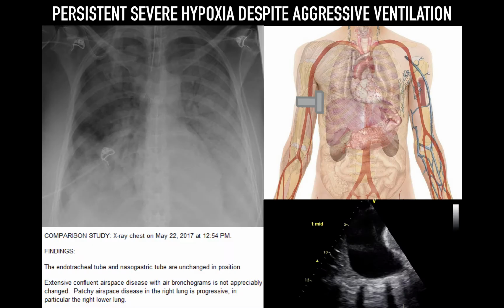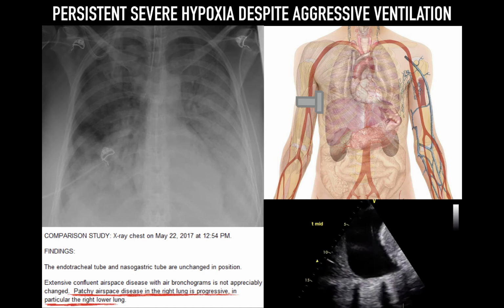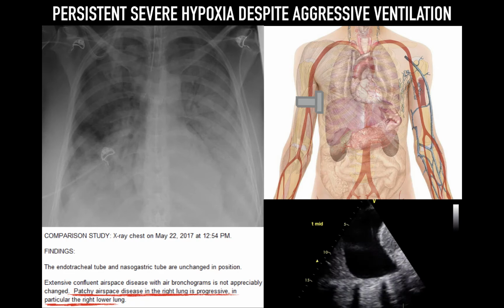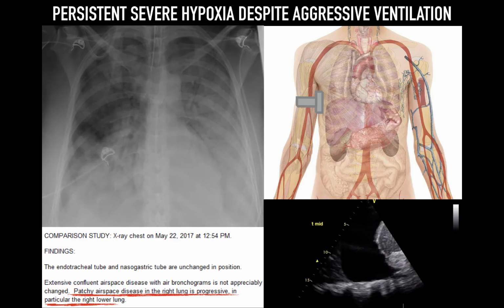The last leg of our lung ultrasound journey is on the famous pleural effusion. I'll tell you, chest x-rays are notoriously difficult to use to diagnose an effusion. And as you begin to practice this skill, you will see more and more the conflict that arises between chest x-rays and the sonographic equivalents, as described here. This is an actual patient where there was a direct conflict between the chest x-ray report and the ultrasound findings.